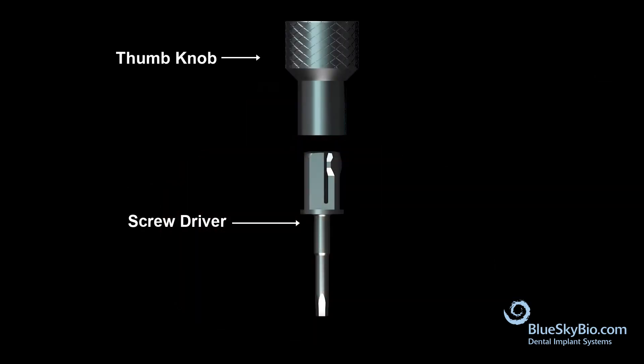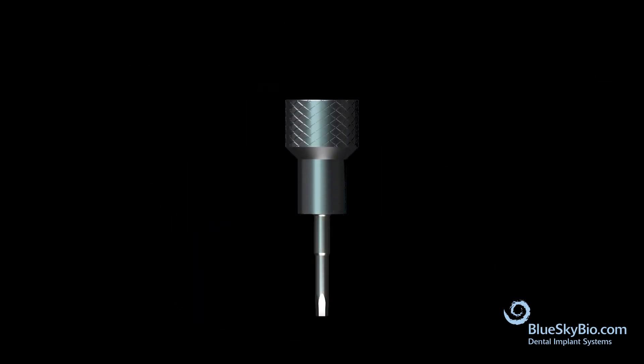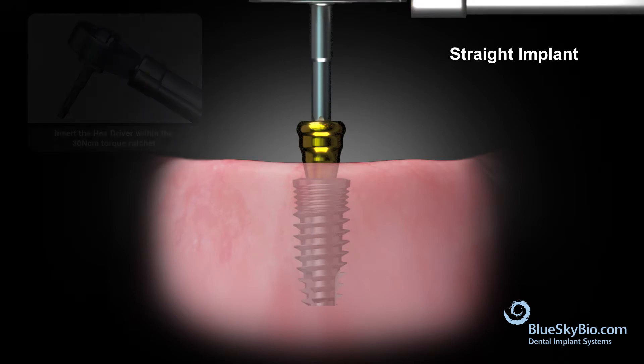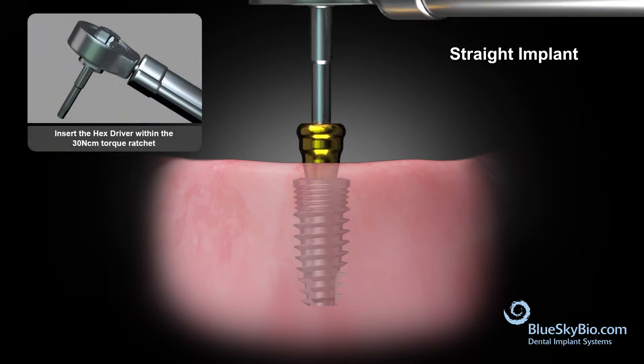Connect the thumb knob to the screwdriver and remove the healing abutments. Insert the abutment into the implant. Tighten the abutment first with finger pressure, then insert the driver into the wrench and torque to 30 newton centimeters.